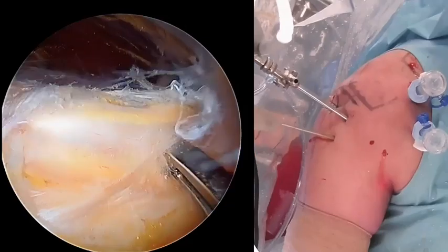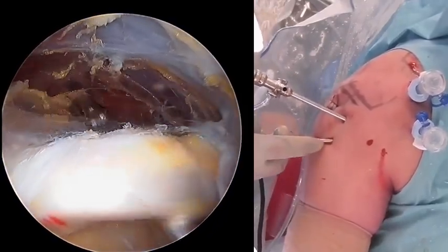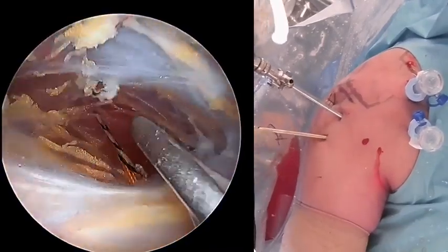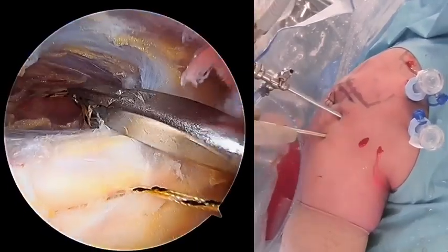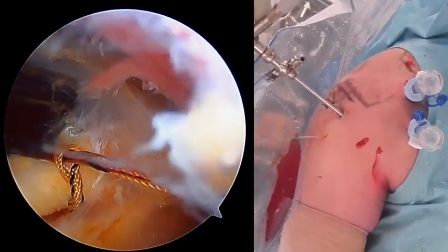Next, a port is made directly below the viewing port, about 2 centimeters below it, and a Kingfisher is used to introduce a suture tape with a loop suture on the end of it around the biceps tendon, locking the biceps tendon as a luggage knot.